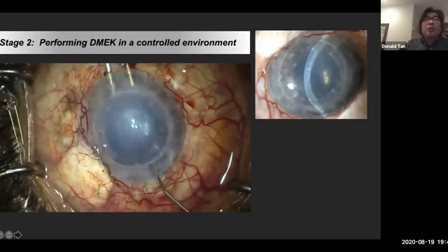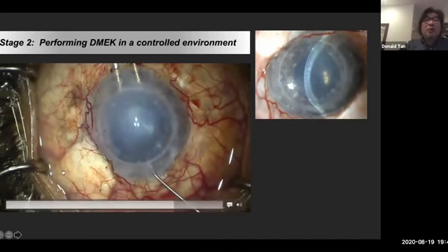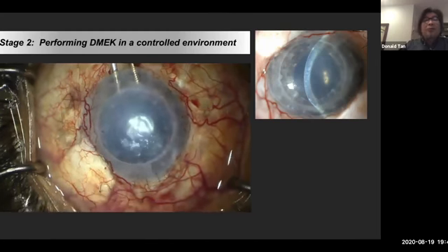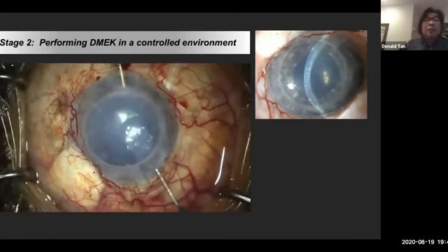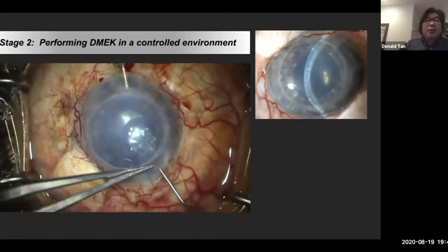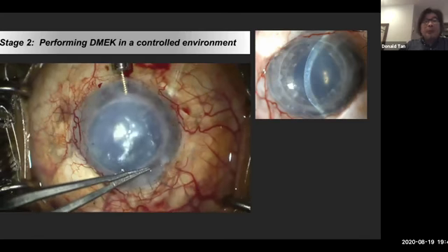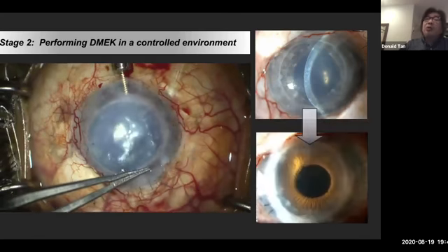You can see there's one tube here, another tube there. So this patient has gone through a lot, and that's the graft. Okay, and then once you close the wound, you can then inject. A good trick is I will press down on the wound to prevent air bubble coming out. That's your DMEK. And this is what it looks like.